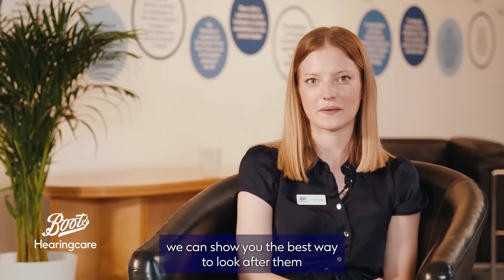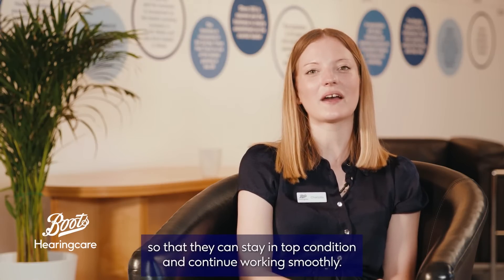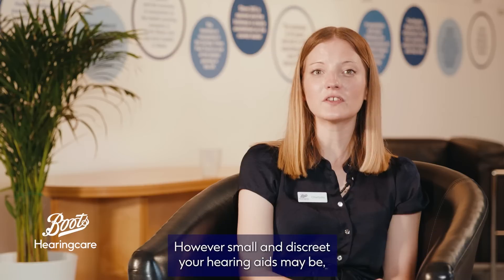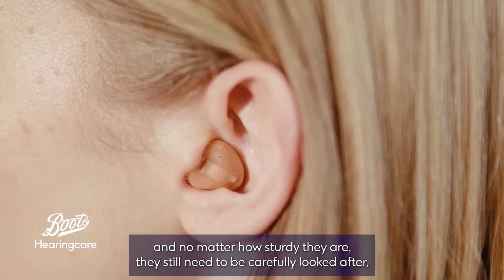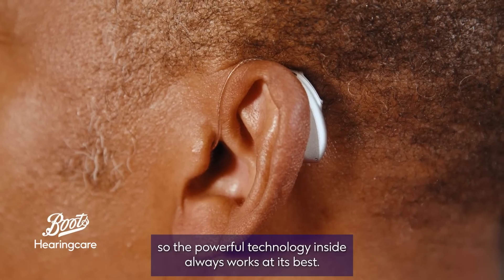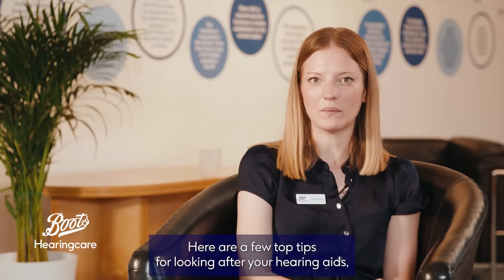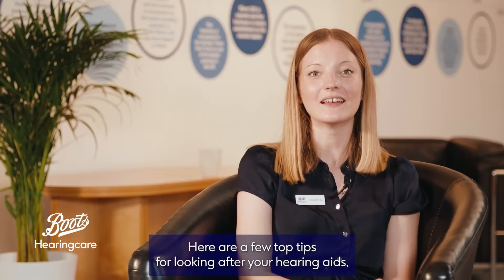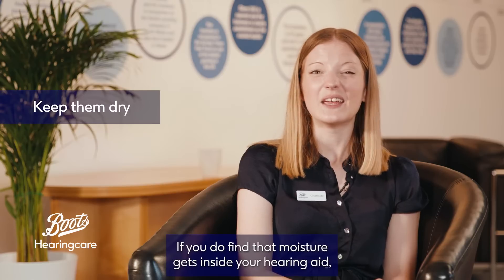Now that we've seen how hearing aids work, we can show you the best way to look after them so that they can stay in top condition and continue working smoothly. However small and discreet your hearing aids may be, and no matter how sturdy they are, they still need to be carefully looked after so the powerful technology inside always works at its best. Here are a few top tips for looking after your hearing aids, including some great products. Keep them dry: hearing aids are water resistant.